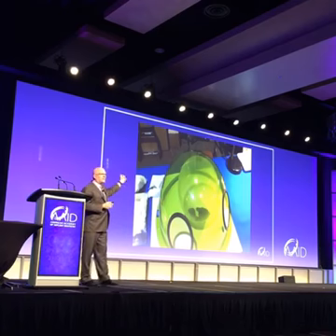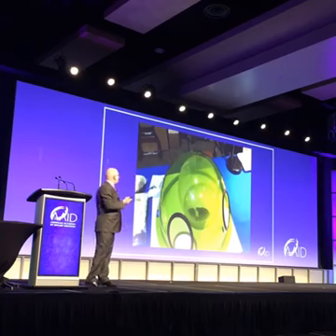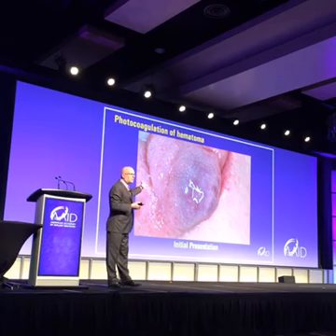This really shows the specificity of what an Nd:YAG can do. No other laser can do this, and this is simple physics. So if you saw this in your office on Monday morning, what would you do?